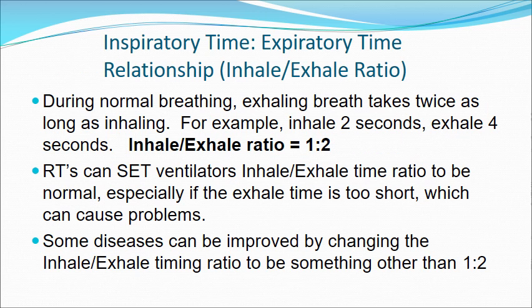Okay, the inspiratory time to expiratory time relationship, or the inhale to exhale time ratio, is important, and normally it's about 1 to 2. So you take about twice as long to exhale as inhale. Now that varies with pediatric and neonatal applications and some other diseases, so it's not always that value. And so RTs can set ventilators.